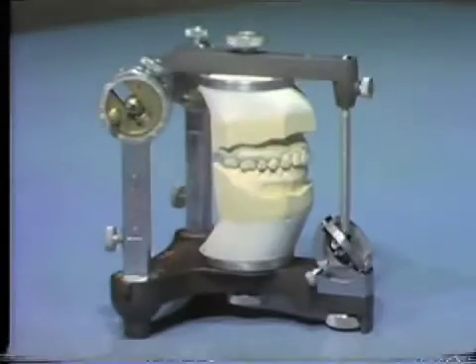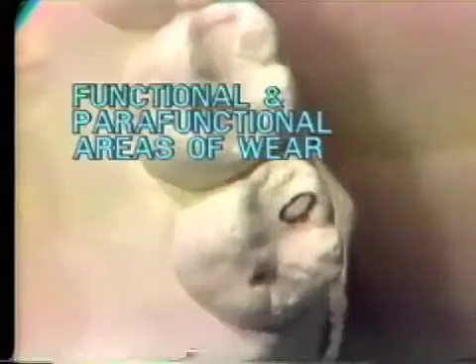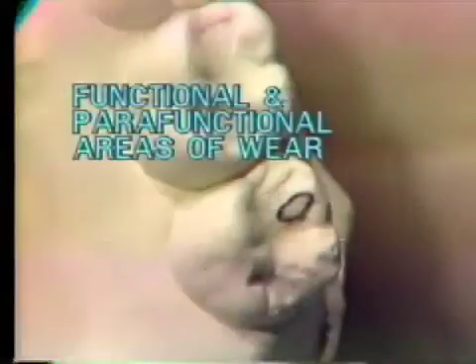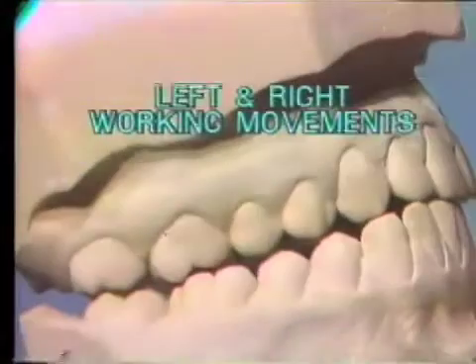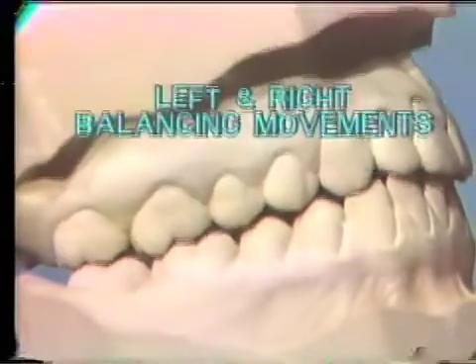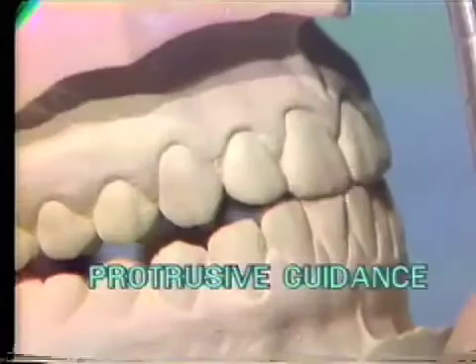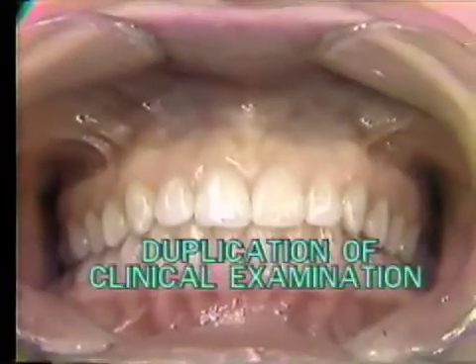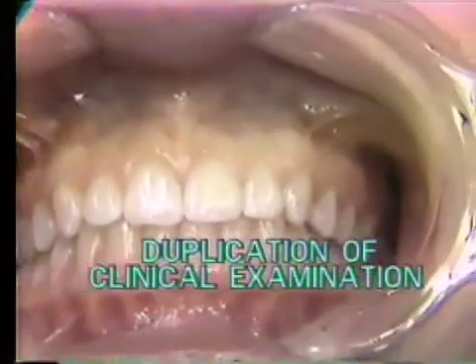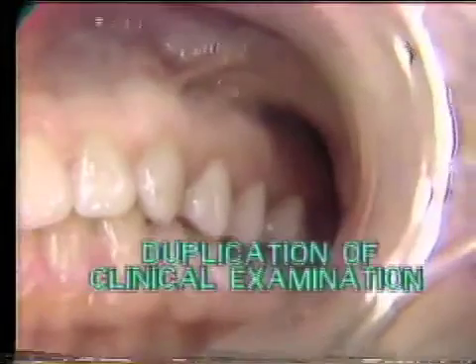The examination of the correctly articulated cast includes an evaluation of the central occlusion contacts, the functional and parafunctional areas of wear on the teeth, the working guidance on the left and right sides, the relationship of the opposing teeth on the balancing sides, and the protrusive guidance. The centric and eccentric occlusal contacts on the cast should duplicate those observed during the clinical examination.